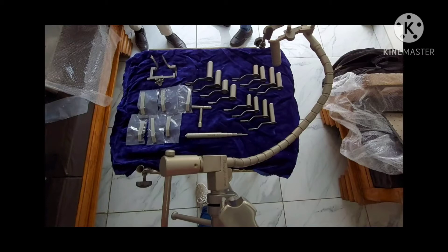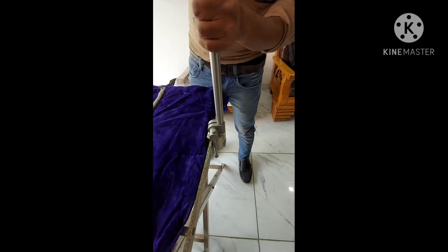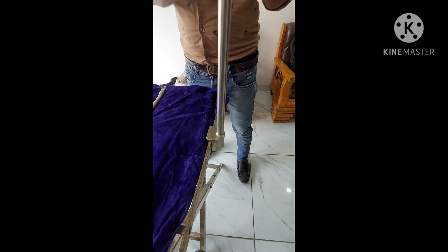Now let's start assembling our tubular retractor. As you can see, our tubular retractor comes in a sterile stainless steel box and contains a sterile post and flexible arm. Now we are attaching the flexible arm with the sterile post.